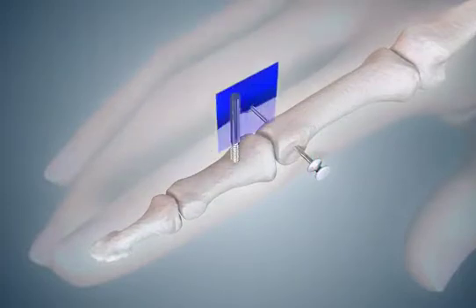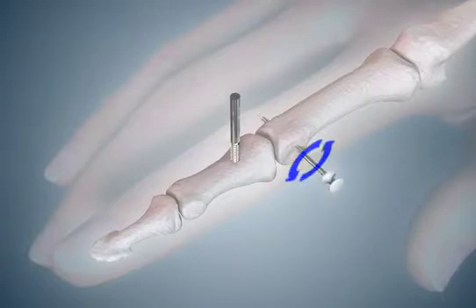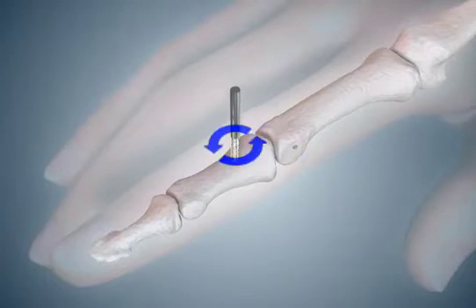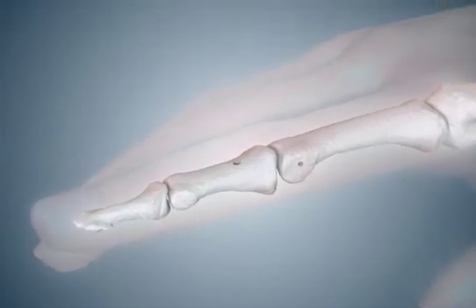Cut a pin cap off the transverse pin on one side of the finger. Using a large needle holder or similar tool, pull and rotate the pin out of the finger. Using the same tool, unscrew the dorsal pin from the middle phalanx. Place a small non-restrictive dressing over the pin tract holes and instruct the patient to continue with range of motion exercises.